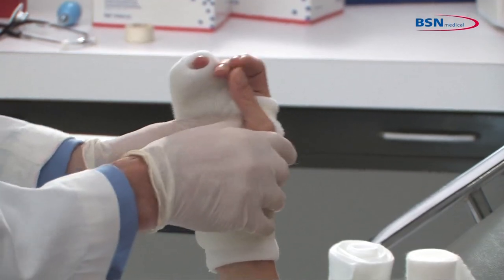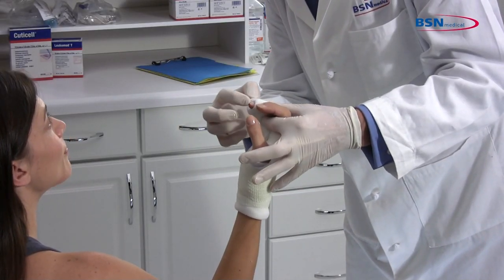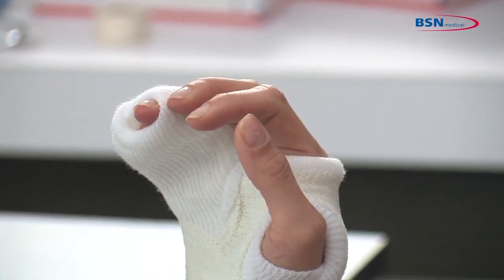Once completed, check for any limitations in range of motion. Following that, check for any pressure points that may cause irritation and you are finished.